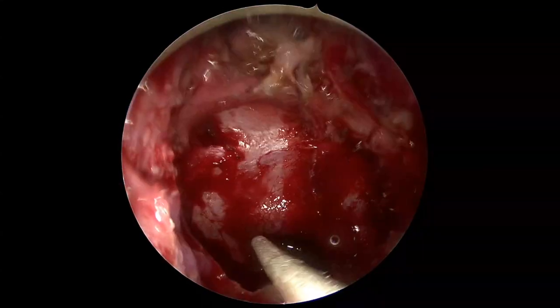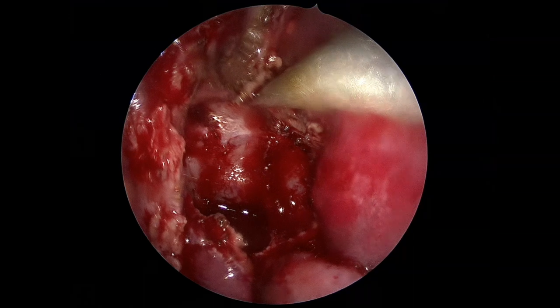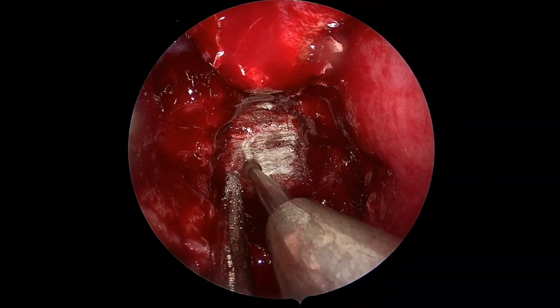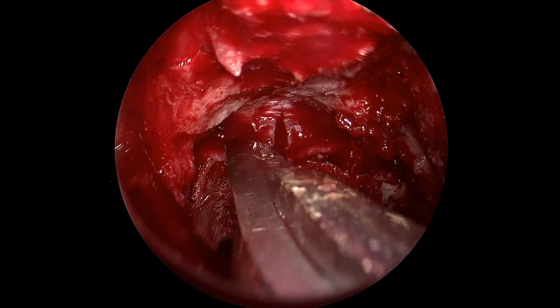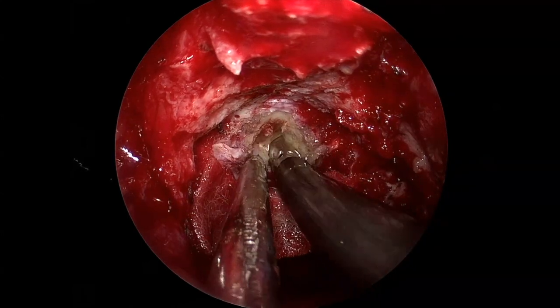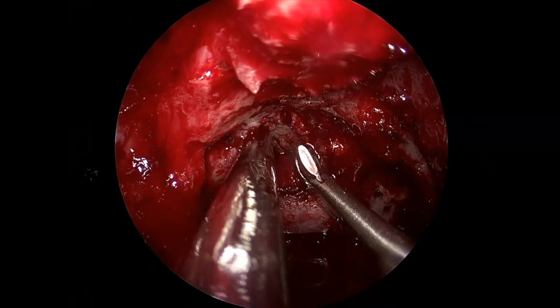Under CT angiography and MRI navigation guidance, the area of the tuberculum and planum under the tumor was drilled out, with the medial opticocarotid recess and the carotids as the lateral limit. After ensuring adequate binostril exposure, the dura was incised with incremental devascularization, and decompression was initiated in the midline base of the tumor using a coblator, curettes, aspirator, through-cutting forceps and knife depending on the consistency.